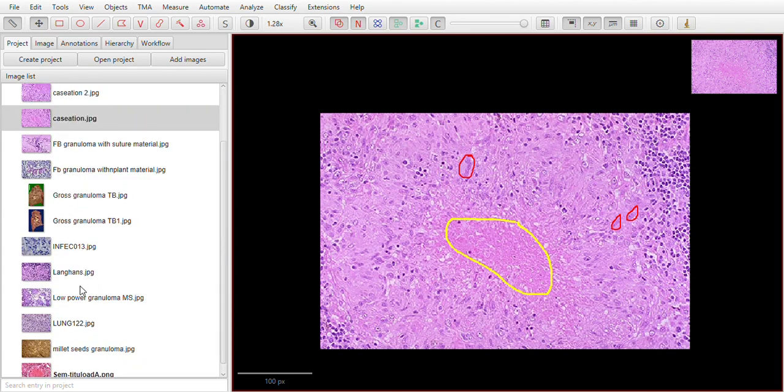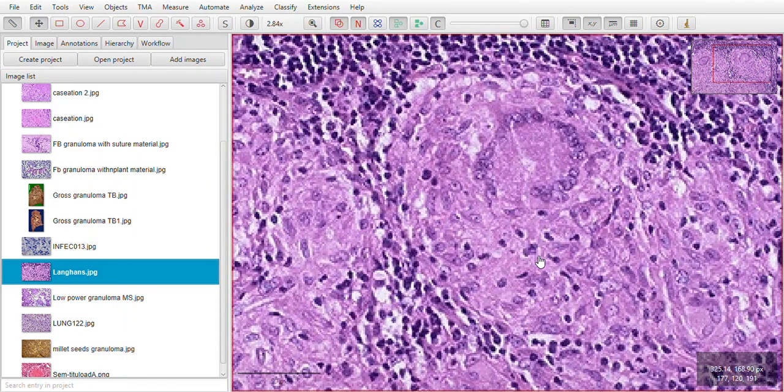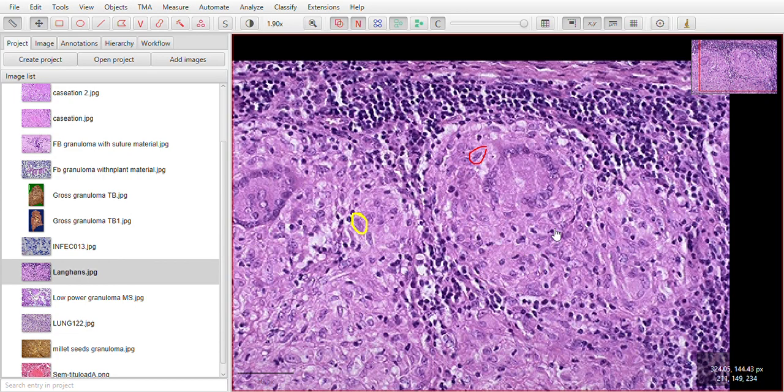Now, if we're talking about tuberculous granuloma, we also need to identify that there is a certain type of granuloma which gives you a typical picture. Typical in the sense that it gives you a confined, well circumscribed area with lots of these epithelioid cells, these elongated ones, but you don't find any caseation necrosis in the center.